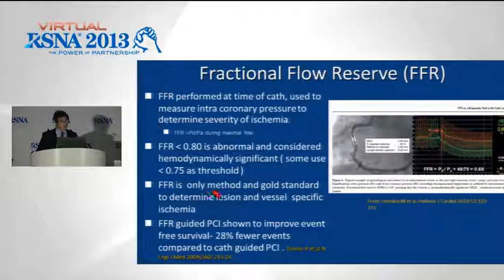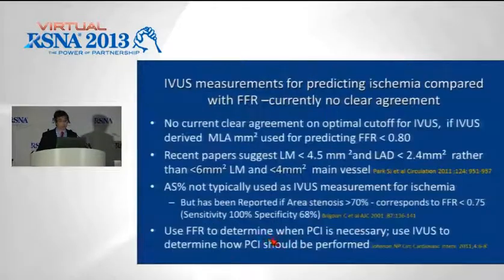FFR is considered the only method and the gold standard to determine lesion and vessel-specific ischemia. And FFR-guided PCI also has prognostic value because it's been shown to improve event-free survival in patients, with 28% fewer MACE events compared to those who had angiography-guided PCI.